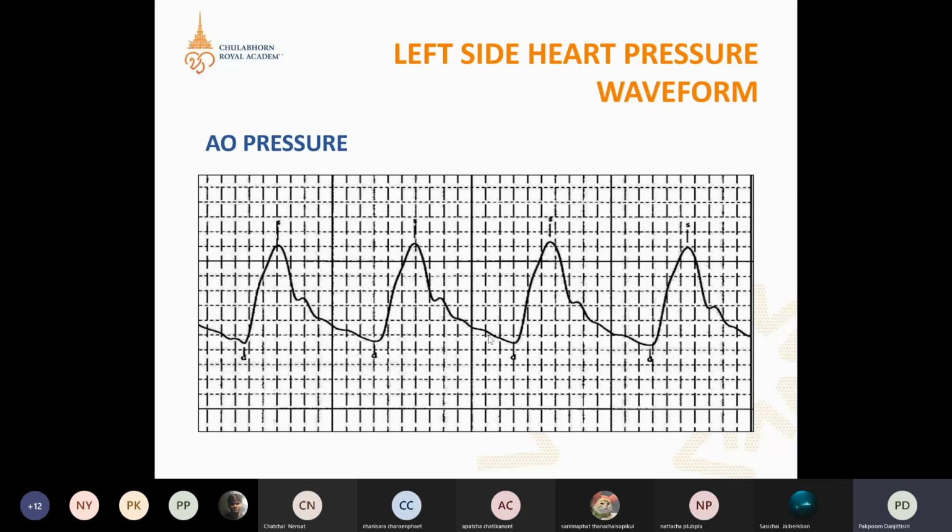So importantly, you have to focus on the hemodynamic screen, because while the physician is trying to engage the ostium of the coronary artery, anything can happen to the pressure. About damping pressure, I'm going to tell you again later.